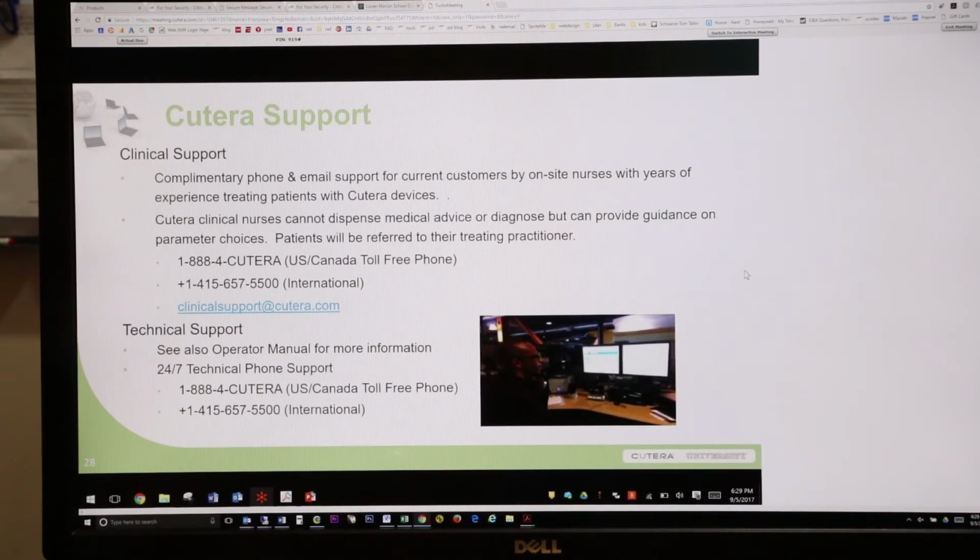And realistically, what you learn over, let's say, the first year after starting to use Pico technology is that, yes, you can treat your patients at 6 weeks, but it makes no difference. It's only putting money in your pocket, but it's not actually letting the tattoo resolve any faster. So you're actually, in reality, back down to every 3 months, which is a better rhythm of treatment. And the tattoo has much more time to fade.